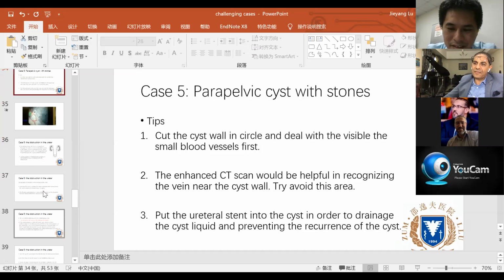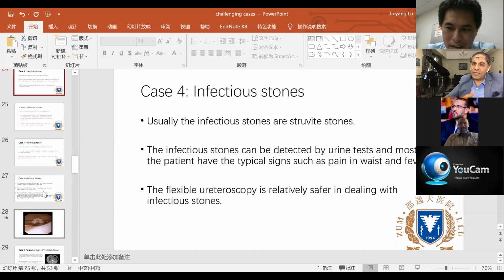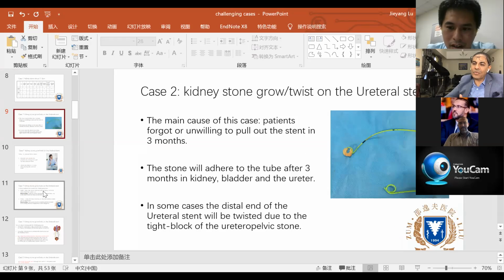Actually, yes. In some countries in our region, the registry of the patient, as you mentioned in the beginning, how to follow up the patient, how to remind, how to counsel, how to inform him. But in Dubai, I can share our experience. We have a registry system, so the patient receives a message when the due time of stent removal comes, even if I couldn't count on my memory. An automated message reminds him that he should come back for follow-up or DJ stent removal. But I was in Egypt before and we don't have that system. So we really face such cases of missed double J stent, complicated with incrustation and stones. And as Dr. Tariq mentioned, sometimes they come after a couple of years, not only a couple of months, with huge stones in the kidney, in the bladder, even the whole ureter.